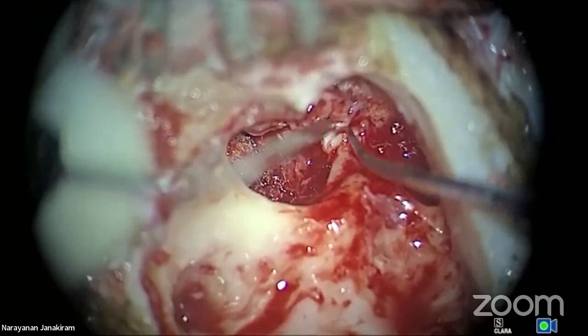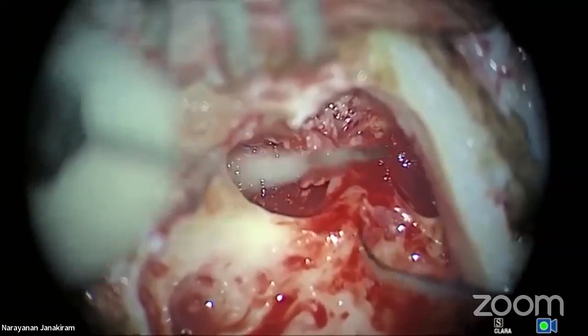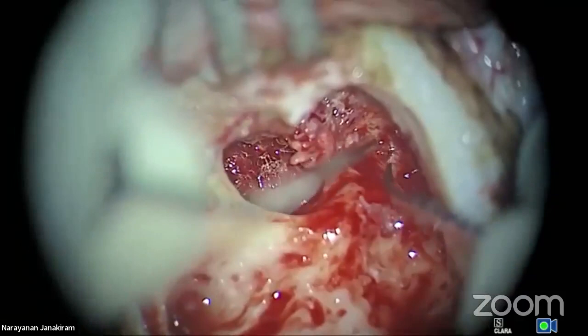See, the facial nerve is dehiscent. Can you see here? And some people are scared, don't do, see the vessel. That is the petrosal branch of the middle meningeal artery. See, that is how the facial nerve goes. That's the first genu, and it turns towards the labyrinthine segment there. Okay, all that anatomy you should know.